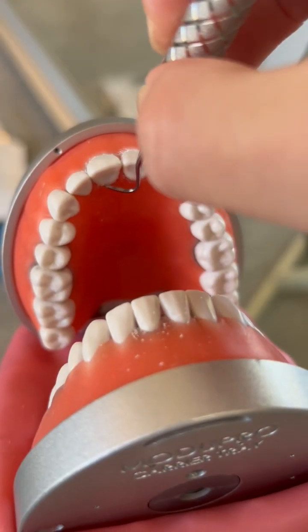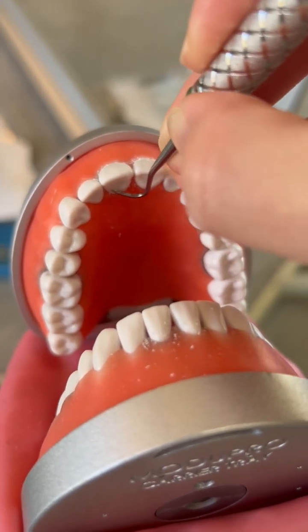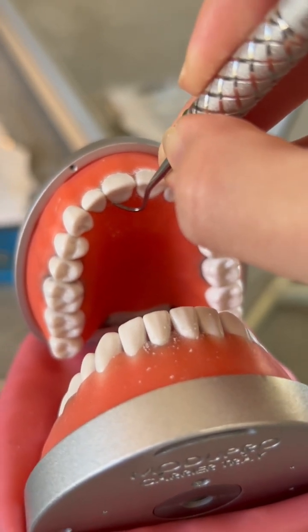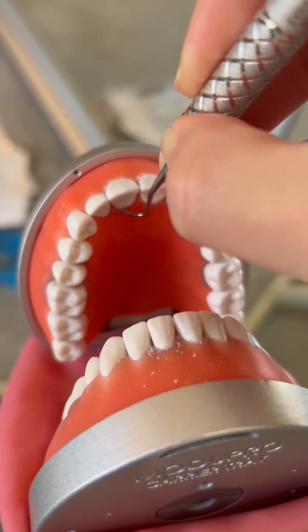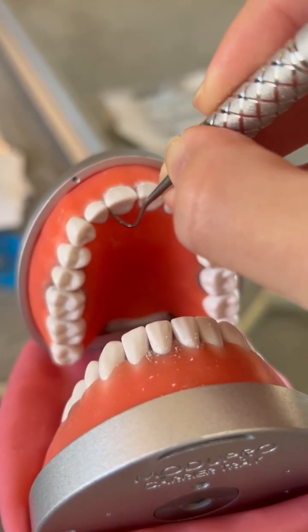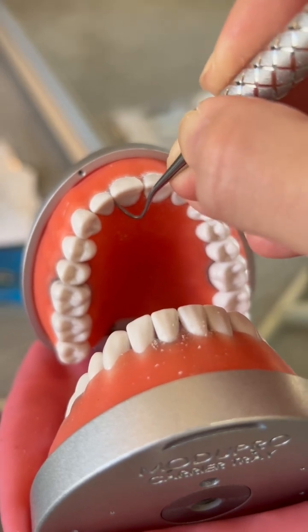And then I'll go towards the linguals. Start at the midline using the opposite blade, the secondary blade. Side to side, pivot and roll, side to side, pivot and roll. Only half of the interproximal space.